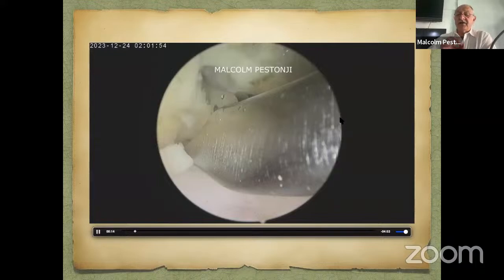Lift and cut to avoid dural tears. So as I lift, you can see through the flavum, you can see my instrument, and you can make sure there is nothing over there. So now I can take the punch and I can bite through it.